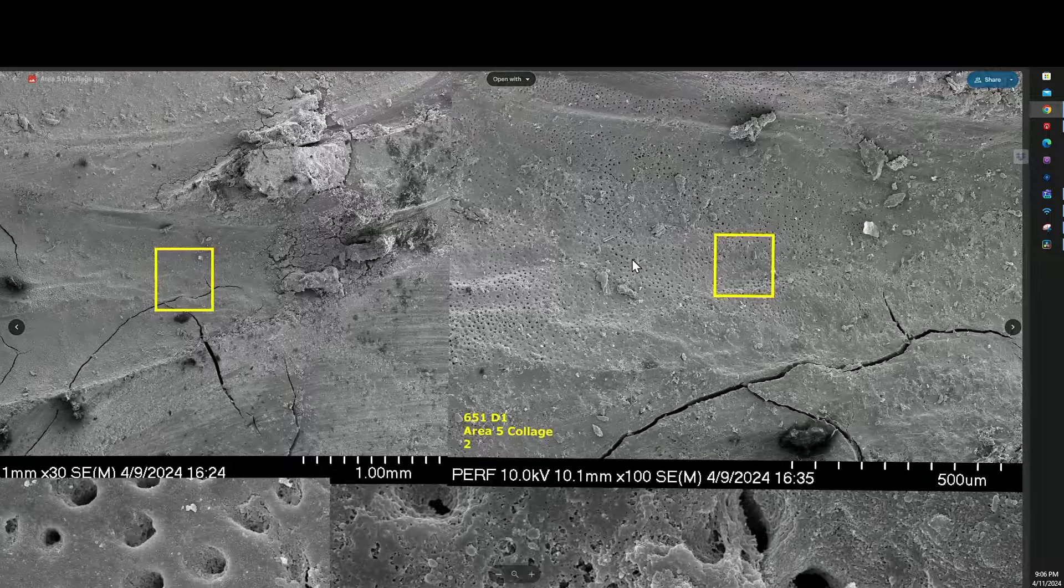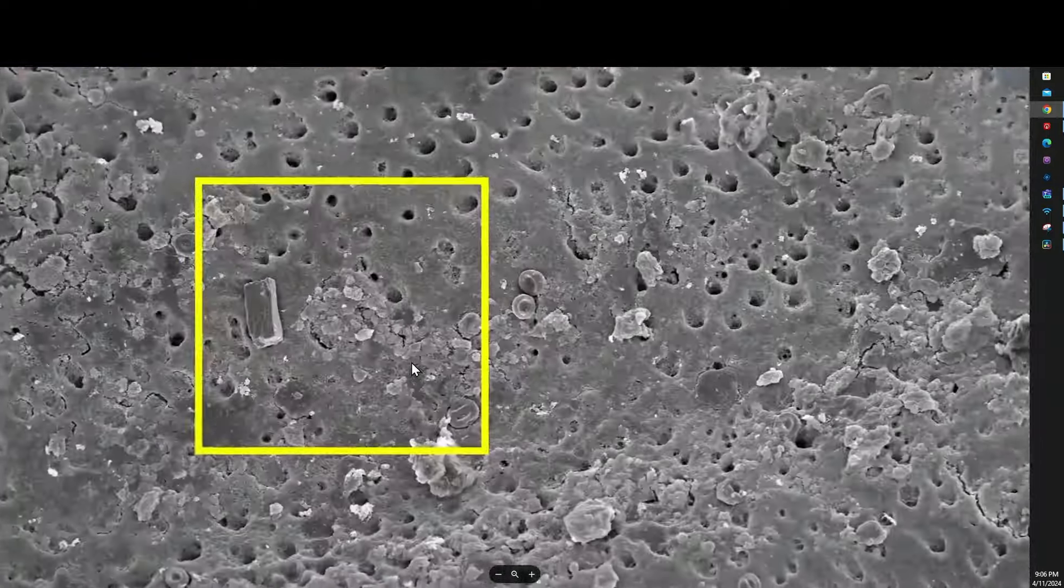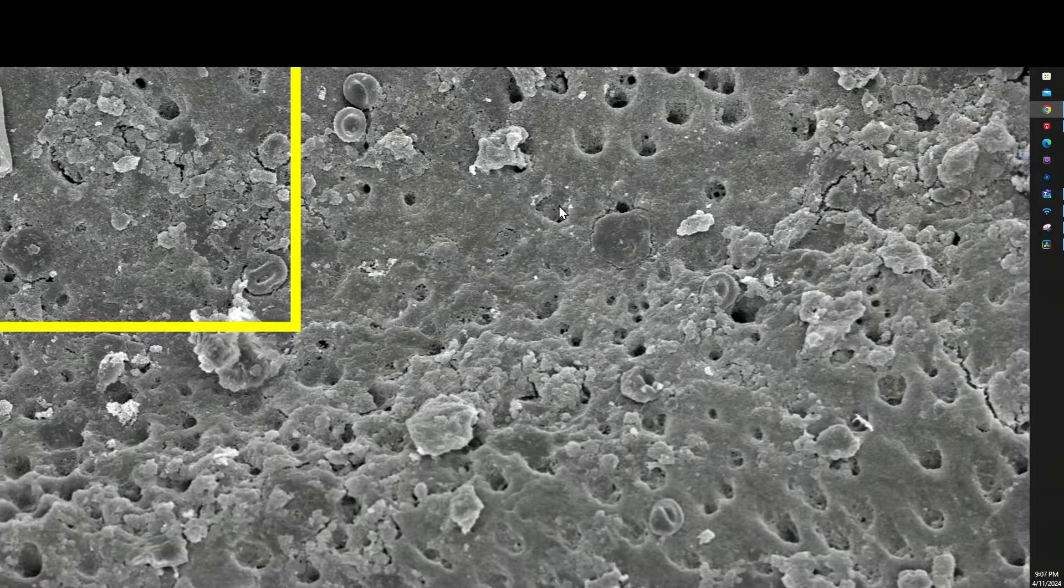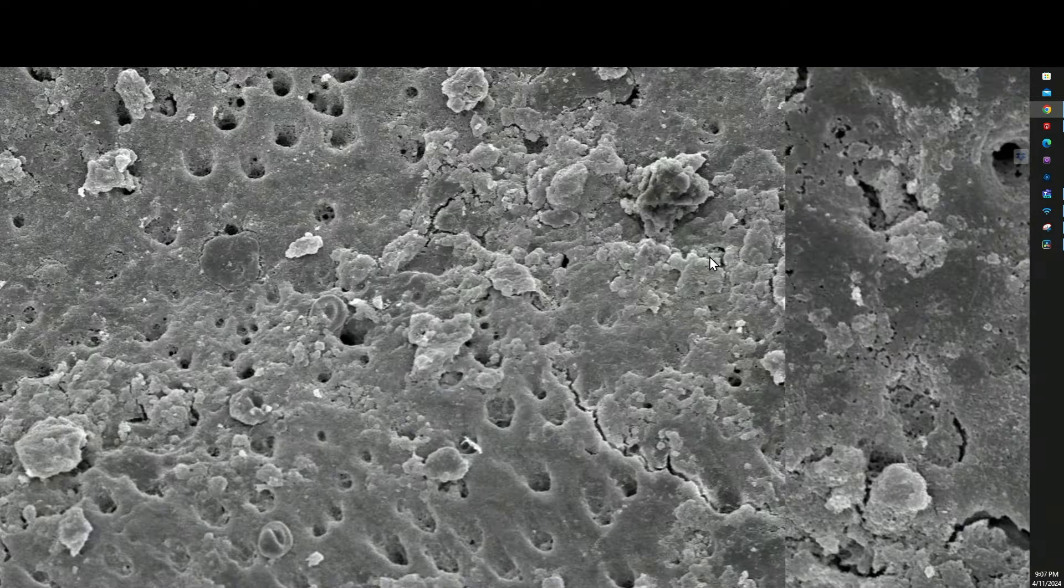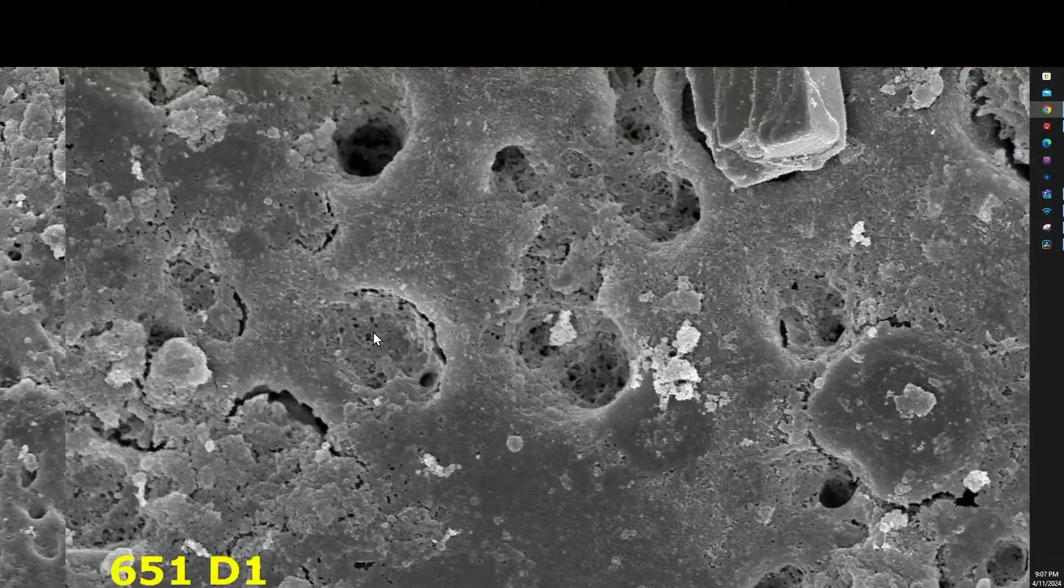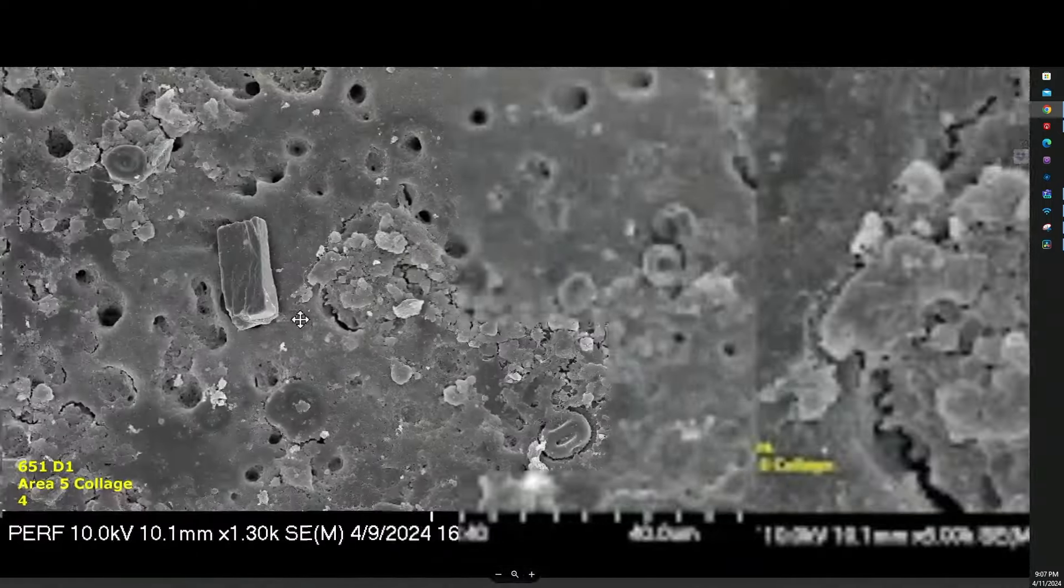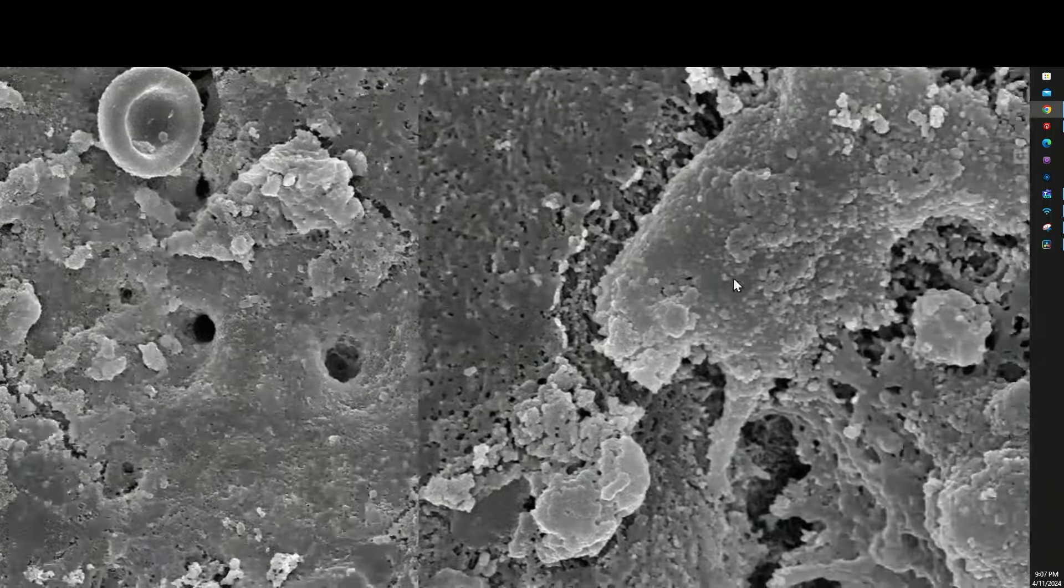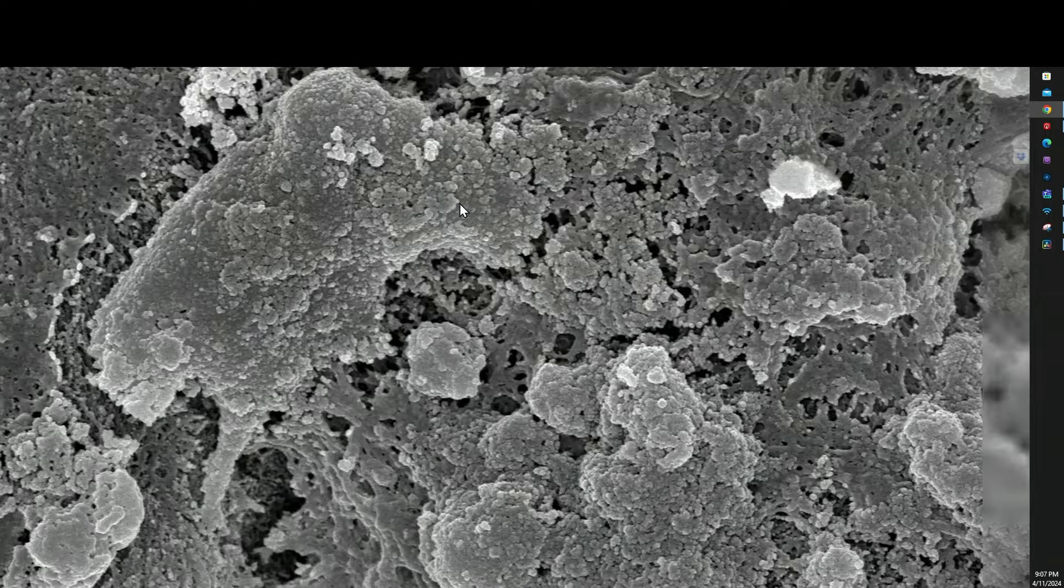And when you look at the areas they look very well cleaned. Almost all of the pre-dentin has been removed and we're right down on the mineralization front. And you can see quite a bit of the mineralization front has started to be demineralized.